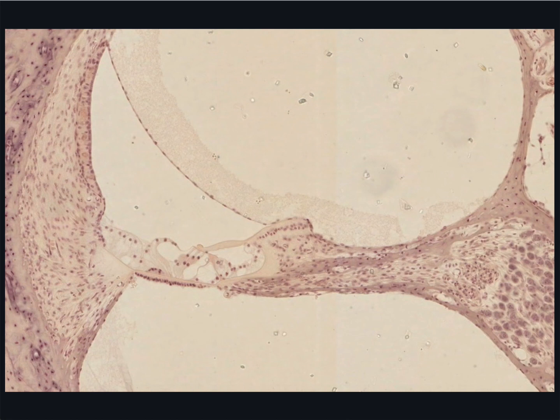Observe each of the following structures associated with the scala media, namely the organ of Corti, with 3 rows of the important outer hair cells. And there would be one of inner hair cells as well, but it isn't sectioned here. And there's a host of other cells that I won't describe. Look at the basilar membrane and the less important vestibular membrane. The gelatinous tectorial membrane, which the cilia of the hair cells are embedded in.